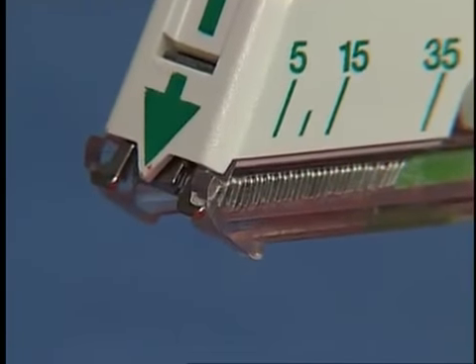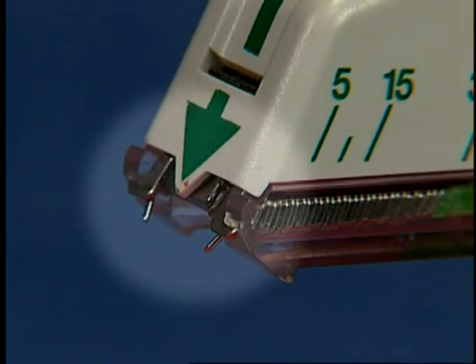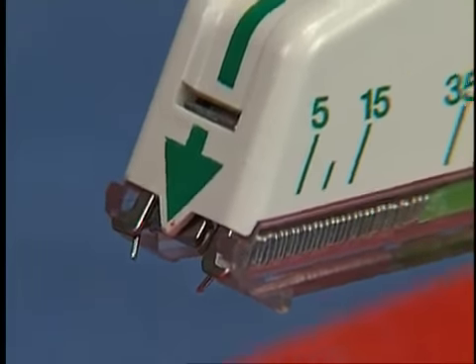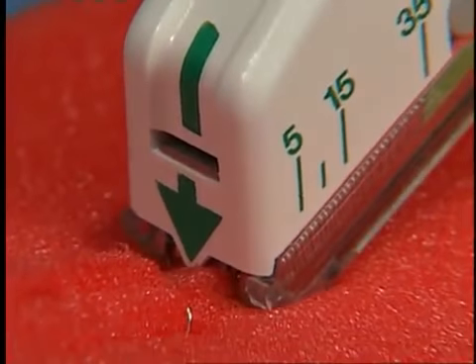Alternatively, the skin stapler can be pre-cocked to enable more precise placement of the staples. Simply squeeze the trigger until the points of the staple are visible and it is in the pre-cocked position. The staple can then be placed exactly where desired and implanted by completing the handle squeeze.